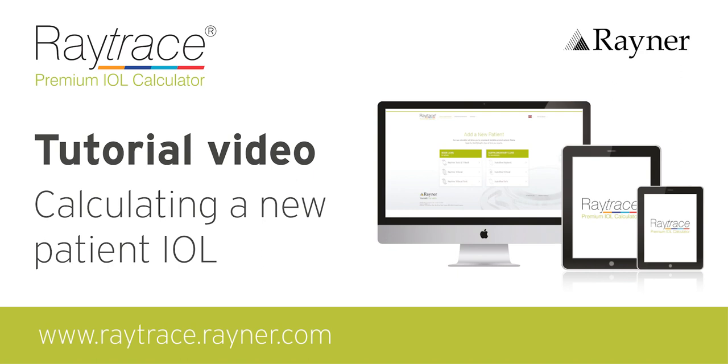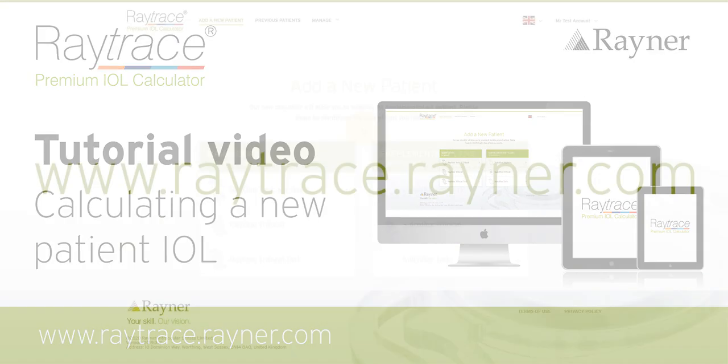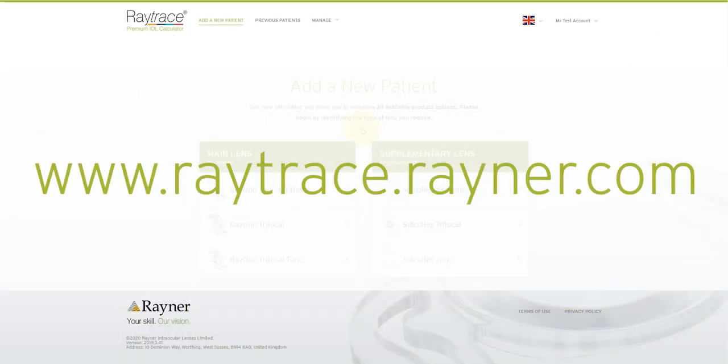Welcome to a short tutorial video on how to navigate and use Raytrace, Rayner's proprietary online calculator for premium IOLs that can be accessed either on a desktop or a mobile web browser. You can log on to or register with Raytrace from www.raytrace.rayner.com.